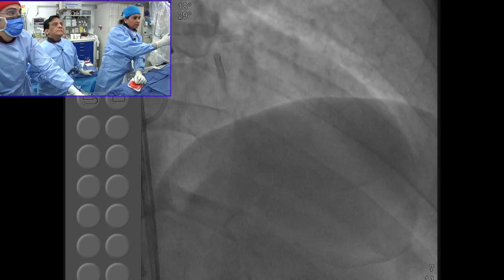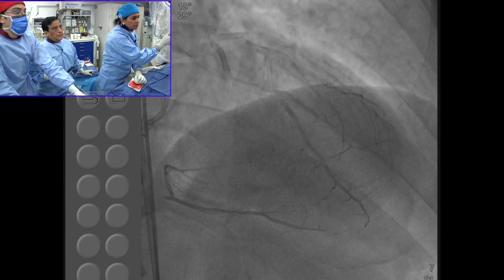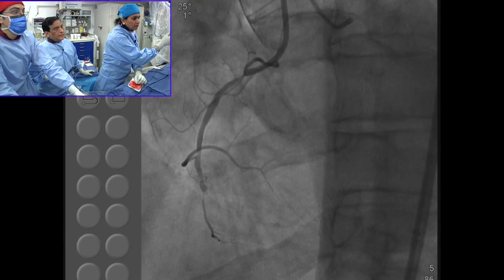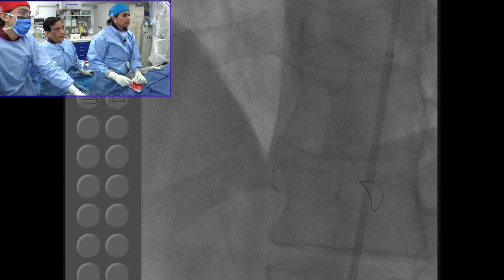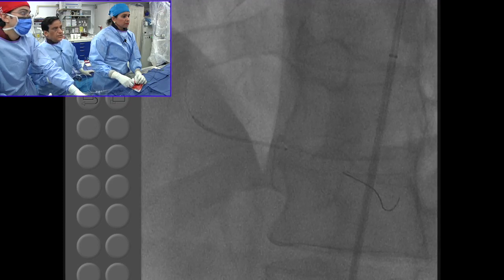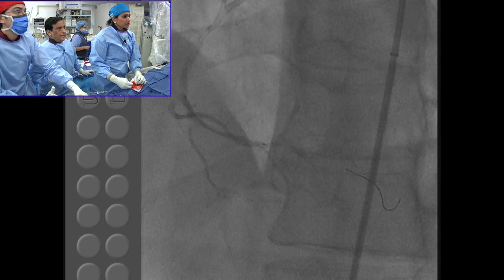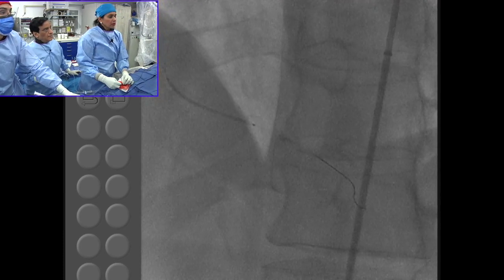Regarding the optimal imaging modality for BVS, do you think there would be any role of OCT or is it all IVUS-based? I think the best for BVS particularly will be OCT, because we need to learn how the stents are disintegrating and where, and OCT will give you better information than that. Clearly, that is the one stent design where you'll favor OCT or IVUS: the BVS.